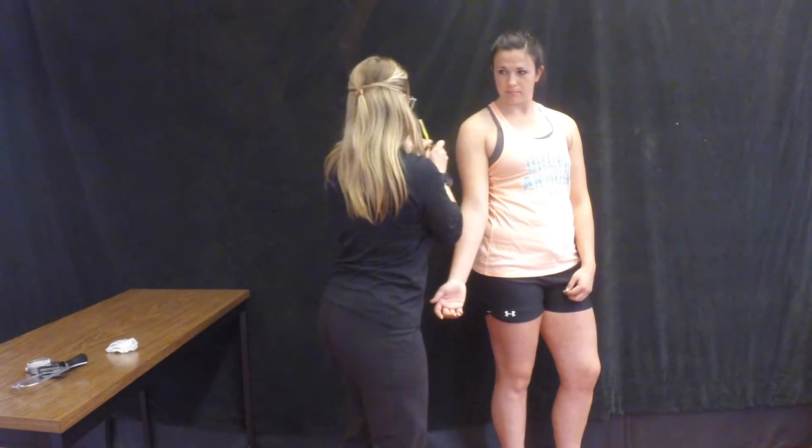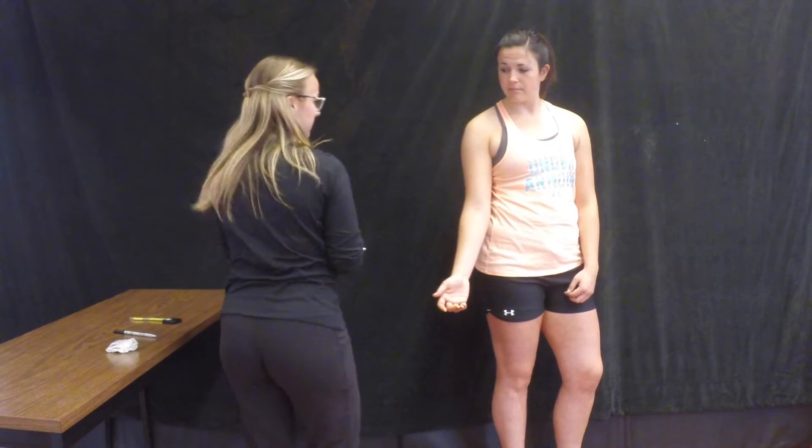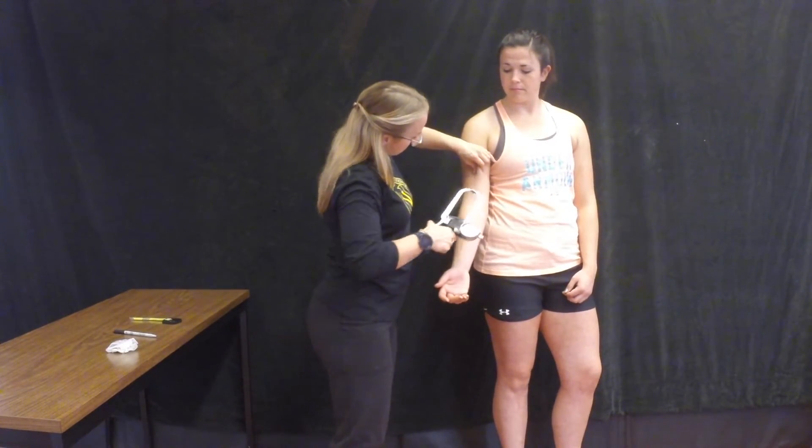This is your skinfold site. The fold runs vertically, so place the calipers 1cm below your fingers.